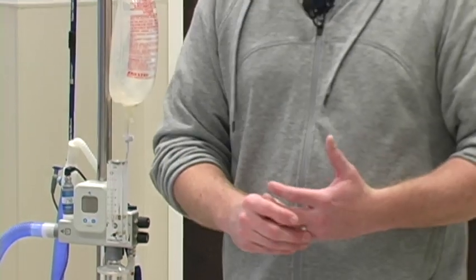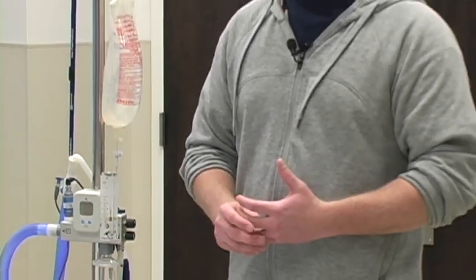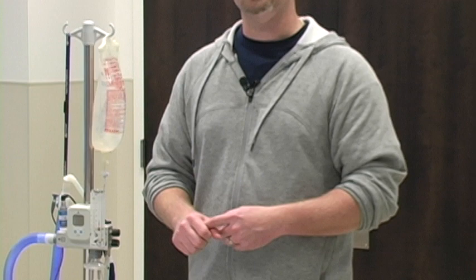Otherwise, for nursing, as far as the responsibilities when they have an Optiflow patient, the biggest one that we can't stress enough is the respiratory assessment. What tends to happen with these patients is they don't look so great, and you call for support, respiratory comes, we end up putting the Optiflow on the patient, and the Optiflow starts to work well, which is what we want to see. Their rates come down, their work of breathing gets better, their SATs increase, and overall they just look better.